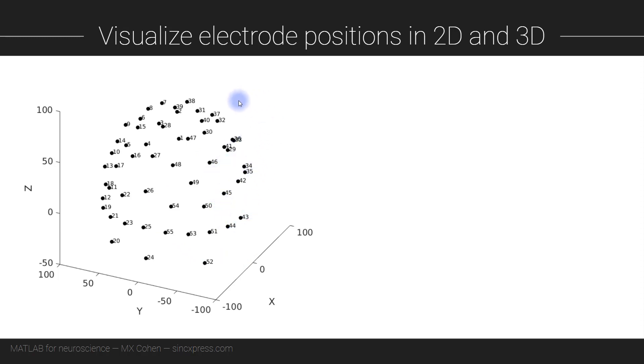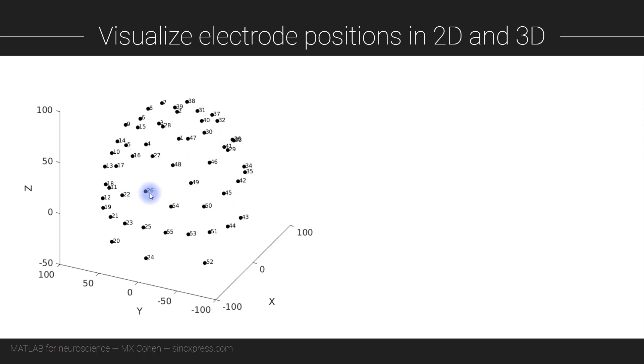What you see here is a 3D plot of the electrode locations where each dot corresponds to the physical position of an electrode and the numbers indicate the index of each electrode in the data set. So this is the 26th electrode in the data set.